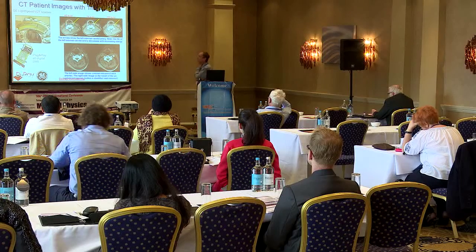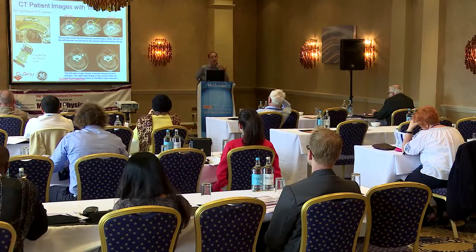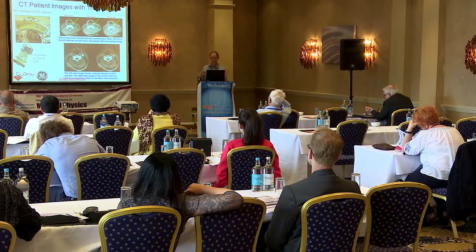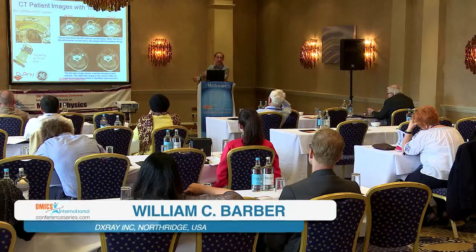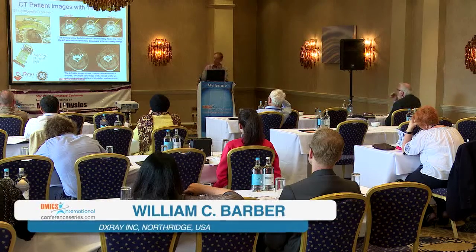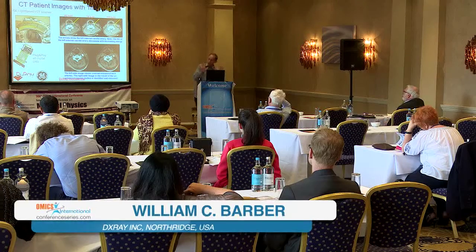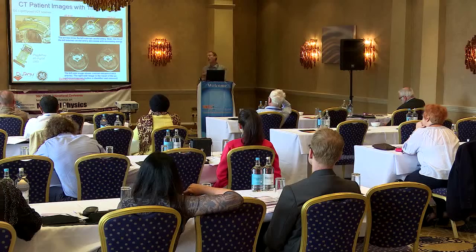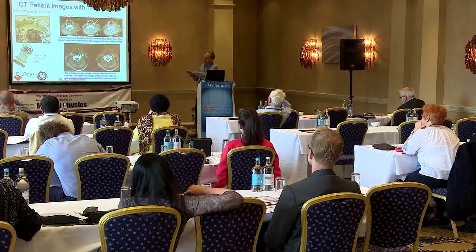So this is a neck study of the carotid artery, and normally a non-contrast scan would be done, and then there would be an iodine contrast injection, and then a second measurement would be made, and those two images would need to be compared or subtracted from each other to separate bone and iodine, which have similar attenuation. But in this case, a single scan can be used, and by binning the X-rays according to energy, we can identify the iodine and then subtract it from the image.